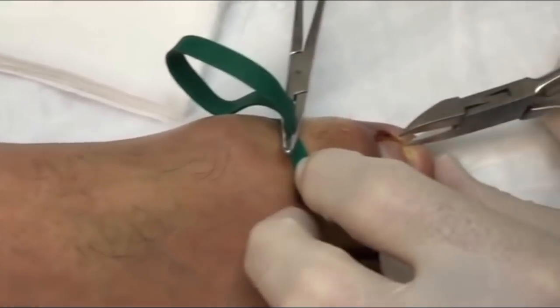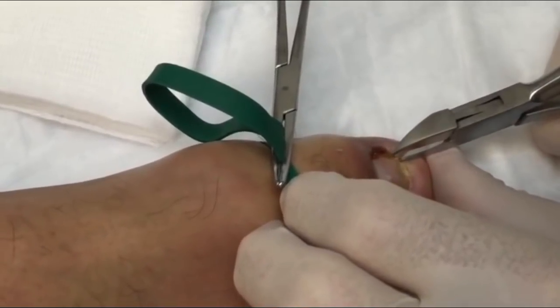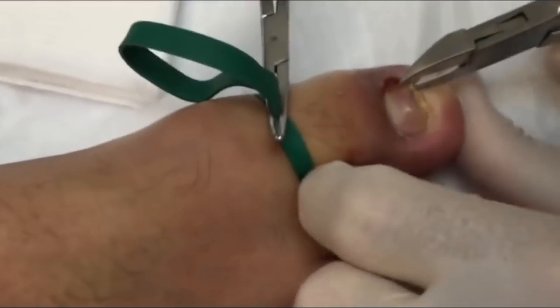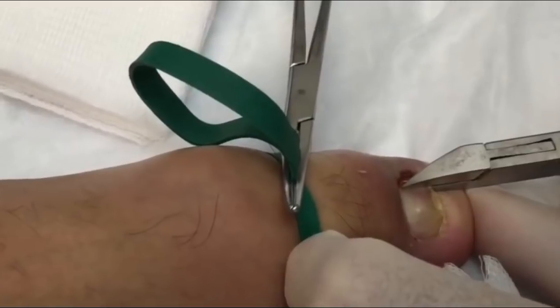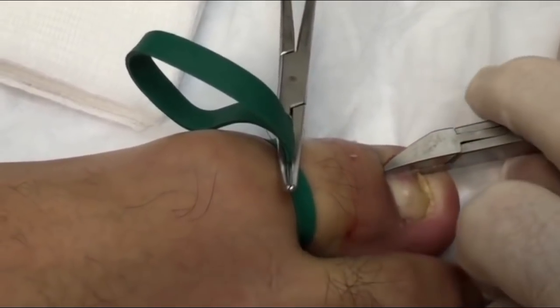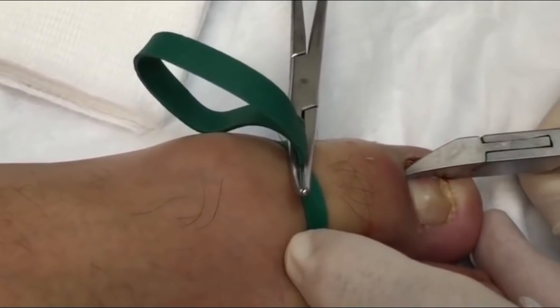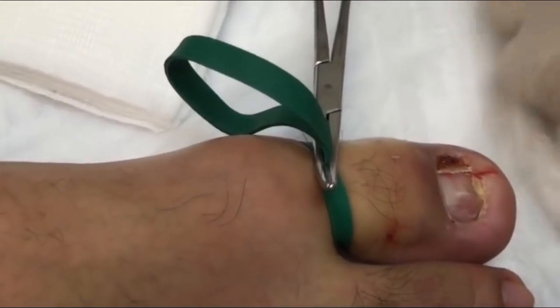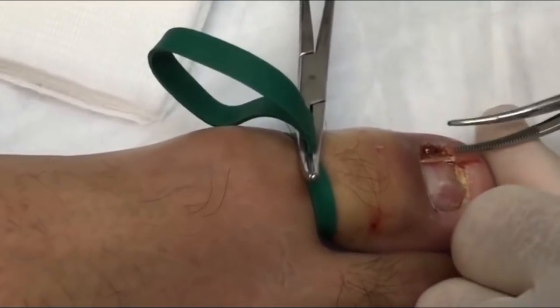If it hurts, you say something, okay? No, I'm good. We're just gently sliding the nail tool under the nail. And it looks like we have a really good anesthesia working here. Because he's not screaming. He also didn't kick me, which I find to be a large plus.